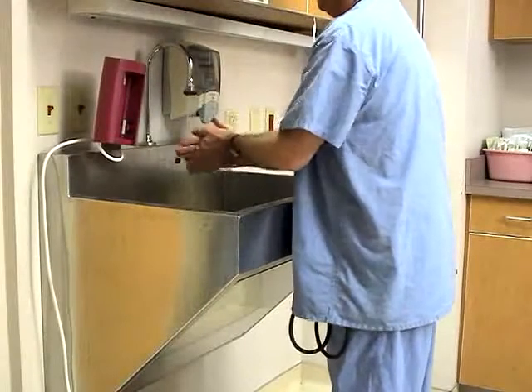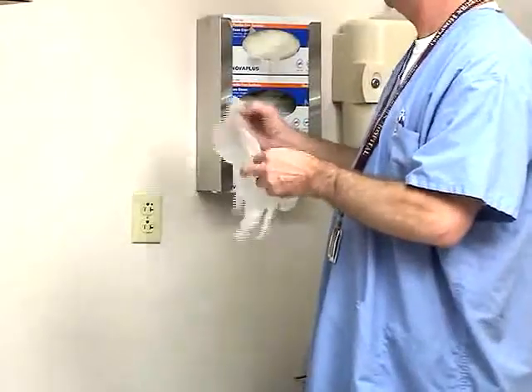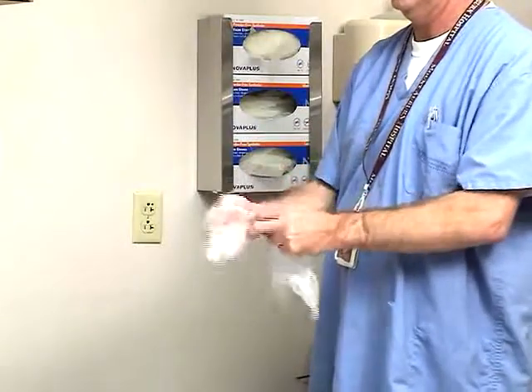Before beginning, wash your hands thoroughly with soap and water. Non-sterile gloves are required during phlebotomy and intravenous cannulation.